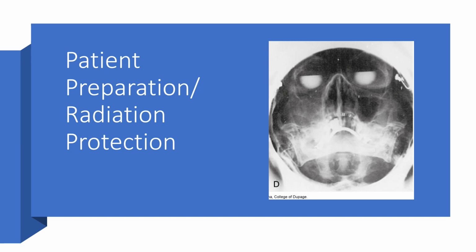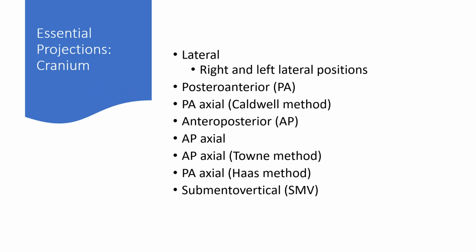This is actually a Waters projection for maxillary sinuses, it looks like, but they forgot to remove the patient's glasses. So glasses, earrings, necklaces all have to be removed before skull radiography is performed. Hearing aids too, if they can be.